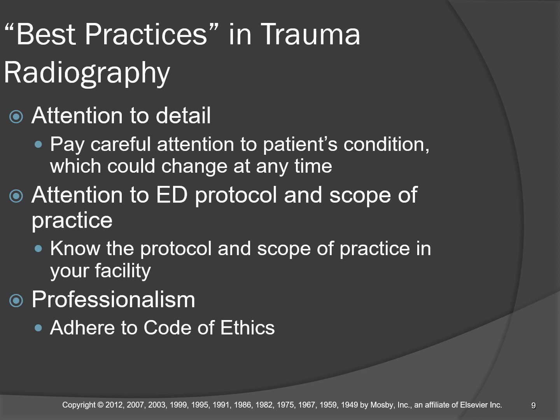You don't want to be so engrossed in getting the x-ray that you suddenly feel warm vomit down the back of your neck, okay? So pay attention to your patient, pay attention to their condition, watch those monitors, right? Watch for them to go abnormal. There's a reason they hook them up to the monitors, guys. It's because they suspect that the patient's heart rate could get out of whack, or the blood pressure could get out of whack, could go too high, too low. The respiration rate could go crazy. They could start panting like a dog and getting real short of breath.